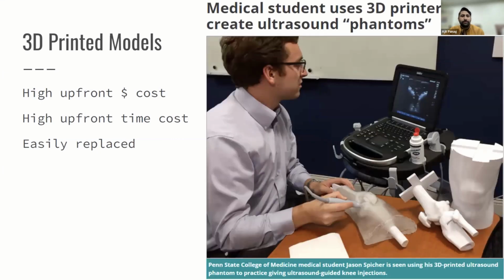And then there's the world of 3D printed models. These have a high upfront financial cost. They also have a high upfront time cost because of the time it takes to engineer the model and create the code to print it. However, once you have that code and that information to give to the printer, and your institution has invested in a 3D printer, you can make many of these.